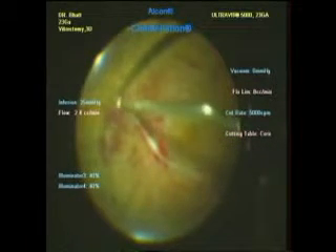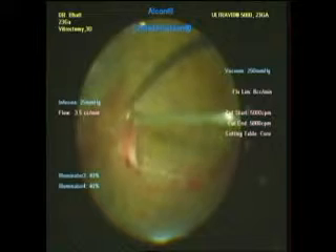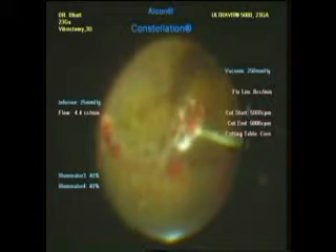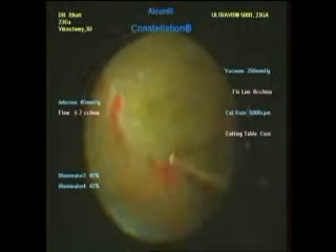You can see a very thick membrane which is attached with the disc, which is gently teased with the cutter to see whether it can get peeled off easily or not. With a few gentle maneuvers the posterior hyaloid gets detached and is removed with the cutter. There is persistent oozing from the disc which is removed with the suction mode of the cutter.